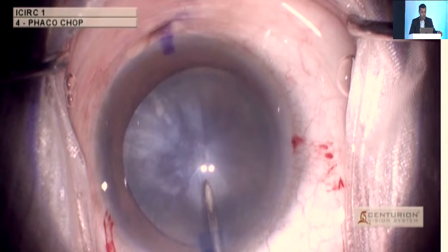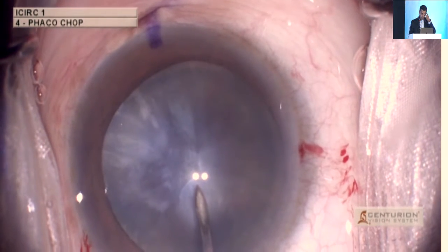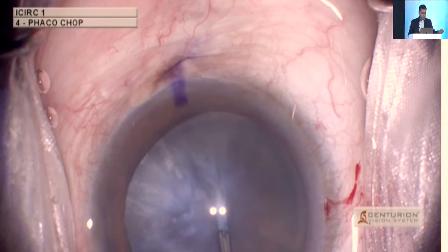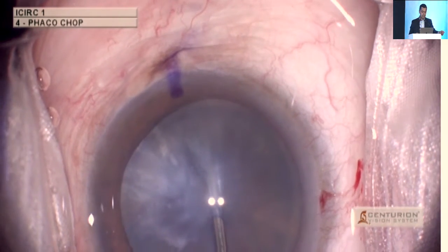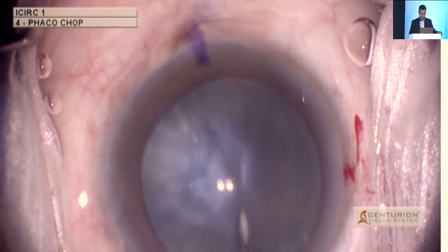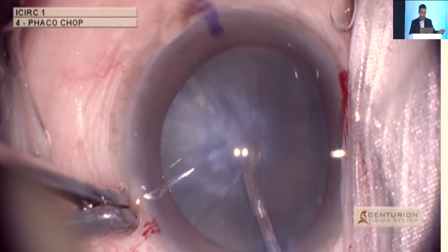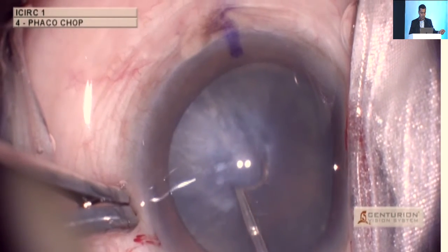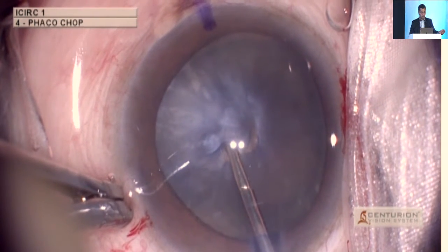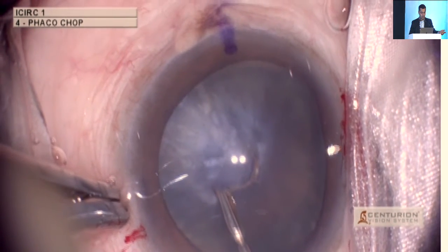You may have an anterior capsule plaque, which may not be apparent when you start the surgery. So here I'm making the puncture to open up the anterior capsule, and one realizes, when trying to move it sideways, that the capsule doesn't give way and you're not able to continue with the rhexis as planned. I don't have a cursor here to move ahead. So I'll show you here, I'm just trying to pull the rhexis up, but because there's a large plaque which wasn't picked up during my slit lamp evaluation, I landed up in a tricky situation. The question is, what do you do now? This is a whole big plaque on this side.